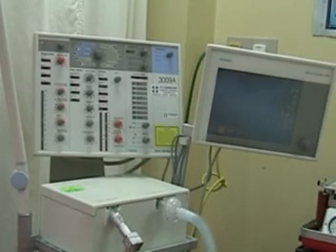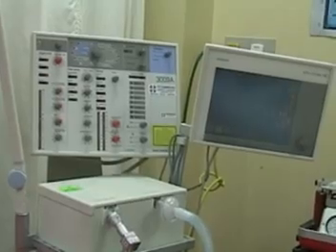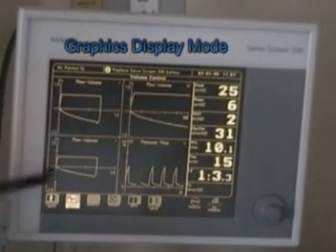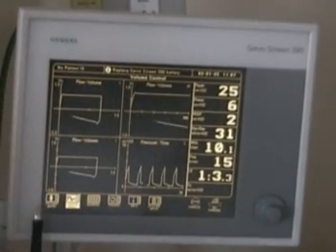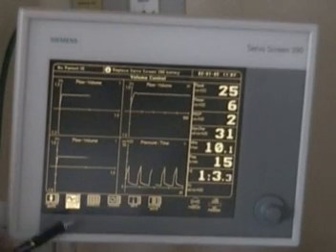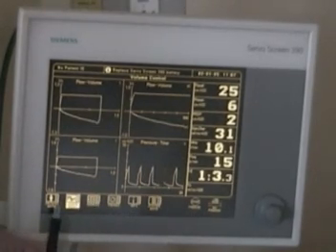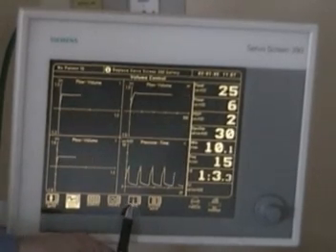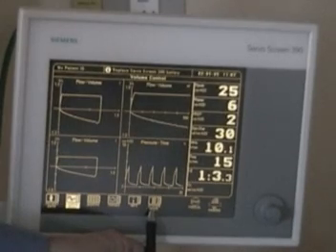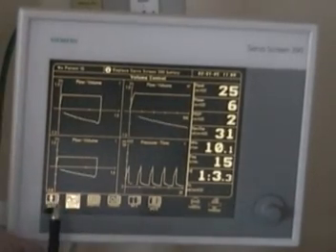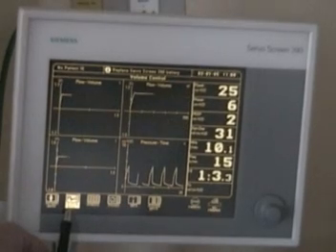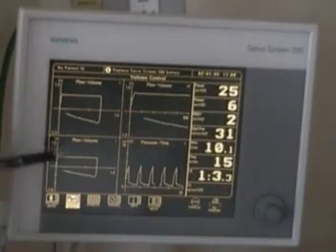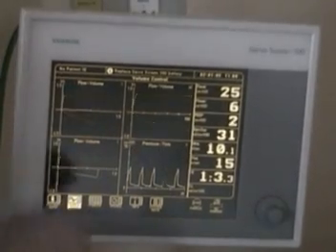Let's take a look at the graphic display screen of the 300 ventilator. Right now we are in the graphics mode. At the bottom you have information — numeric information, curve menu, patient data, trends, info, and system data. Typically in use you'll probably have this in the trend and curve menu so that you can see your flow-volume loops and also your pressure-time.